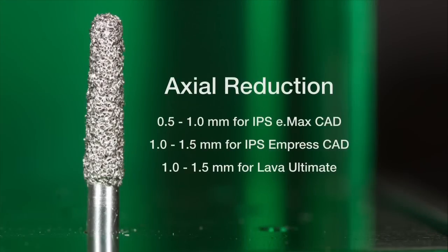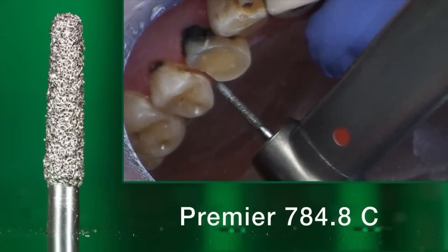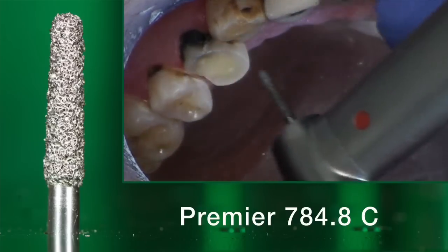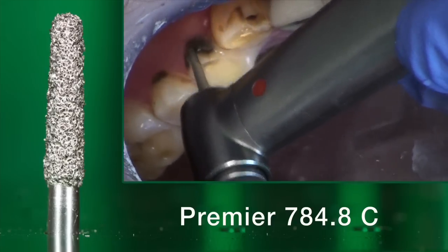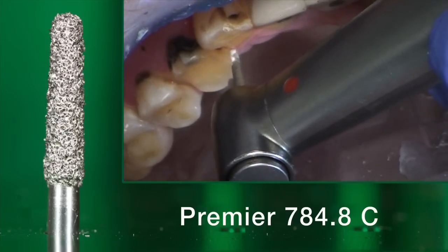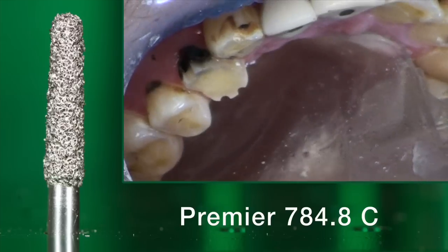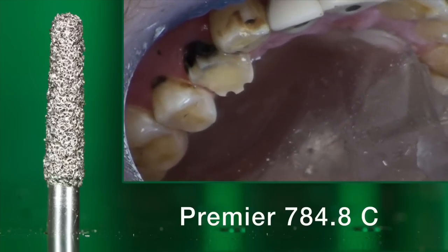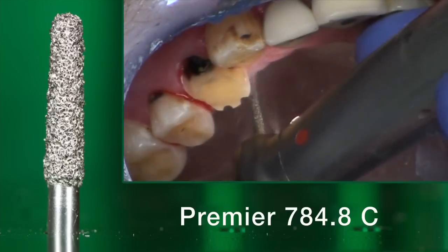Next, we're going to go straight into the axial reduction for this tooth, taking into consideration the material reduction requirements for the material we have selected. I'm going to use a round end tapered burr. Just as we did with the occlusal surface, we're going to create some indexing reductions. These reductions will give us guidance as to the depth to which we want to reduce the axial surface all the way around. I'm going to sink about half the width of this particular burr into the axial wall of the prep, which will give me about a millimeter of reduction. Then we'll go around the circumference of the tooth and connect these depressions, ensuring about a millimeter of reduction all the way around.